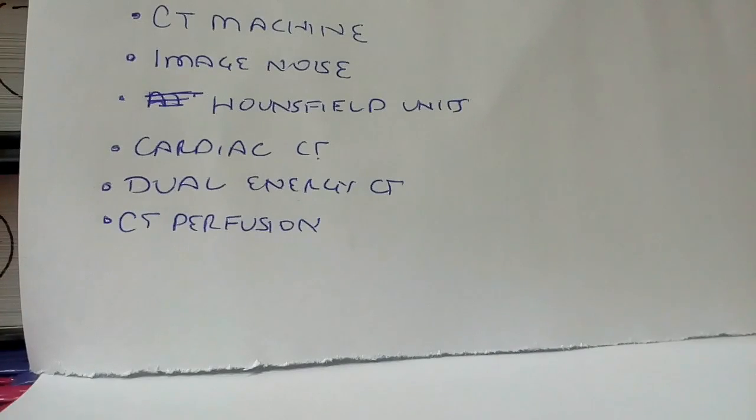Hounsfield unit is basically a unit to measure the attenuation amount of the CT scan. For water it is 0, for fat it is -100, for air it is -1000, for blood it is around 80, and anything more than 150 will generally be calcification or calcium.